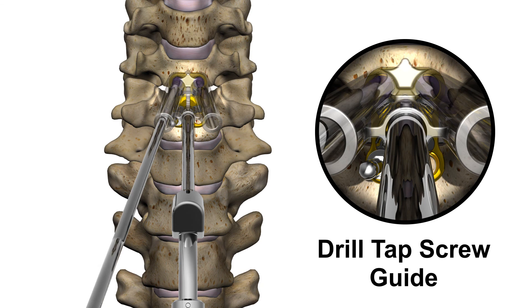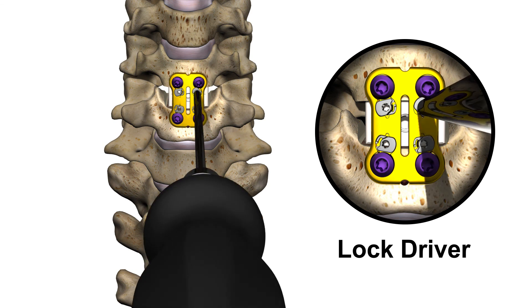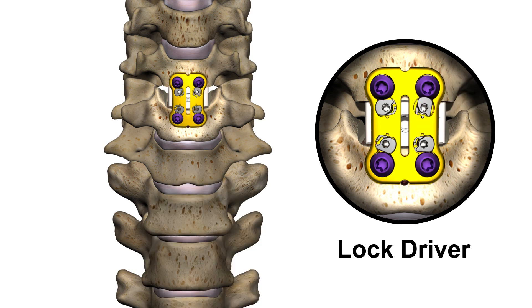Ultimately, the plate is secured to the vertebral bodies using bone screws. Once the screws are securely in place, the locks are turned to prevent screws from backing out post-operatively.